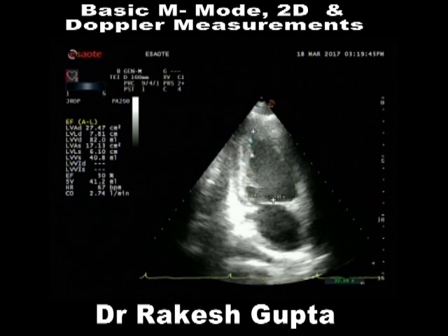So this boy has almost 53 plus 50 divided by 2, almost 52% ejection fraction. This is what is recommended today, at least by biplane view. And best would be triplane. Use an apical long axis and then it gives you global ejection fraction.